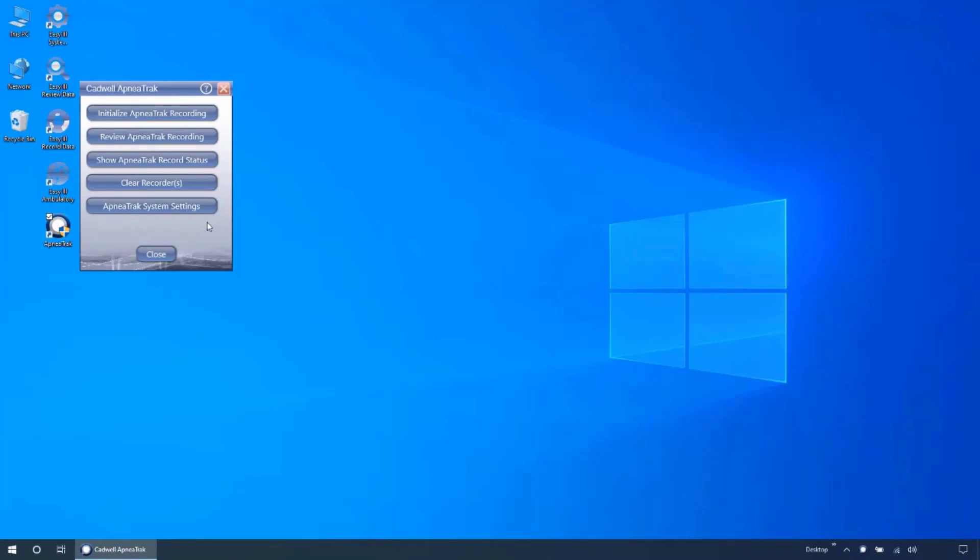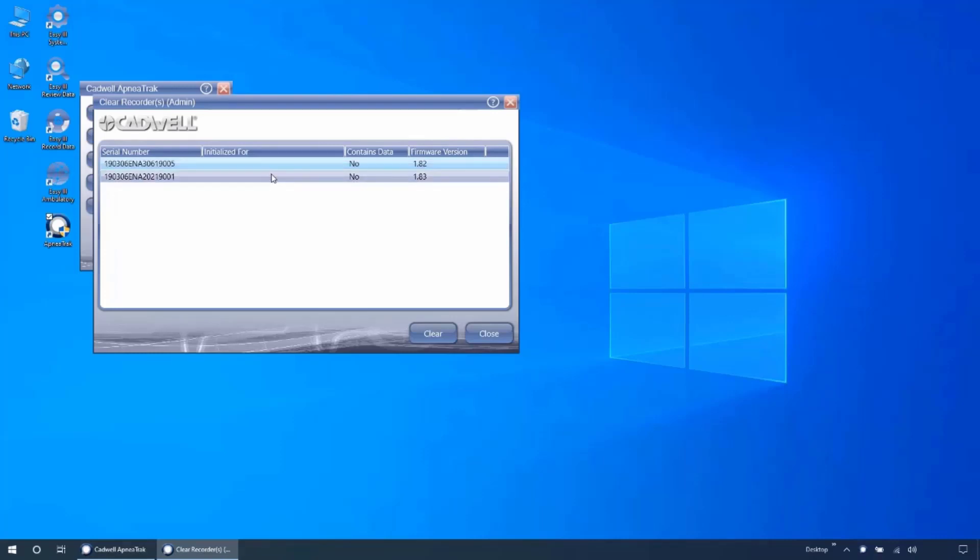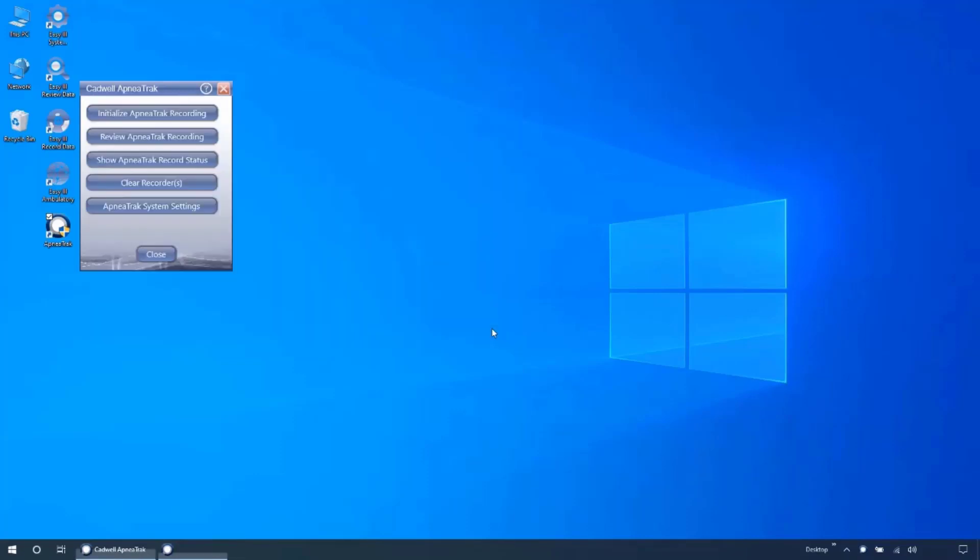The clear recorders menu will show you all connected ApneaTrak and allow you to clear initialization or data from the device. If you ran a test recording or initialized for the wrong patient, this window will allow you to clear the device so it is ready for the next initialization.